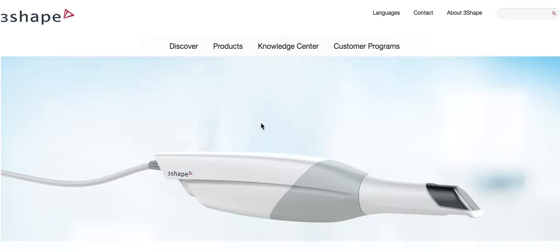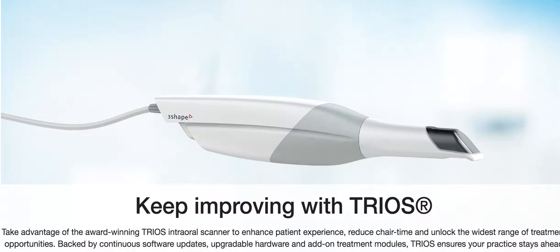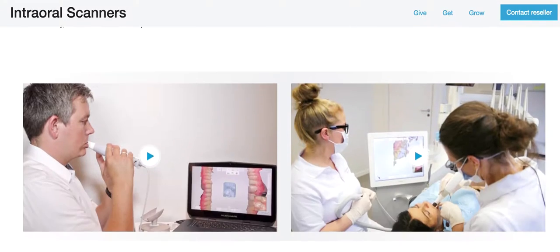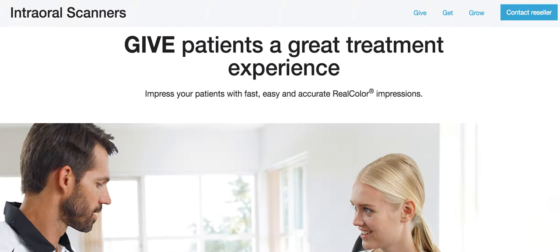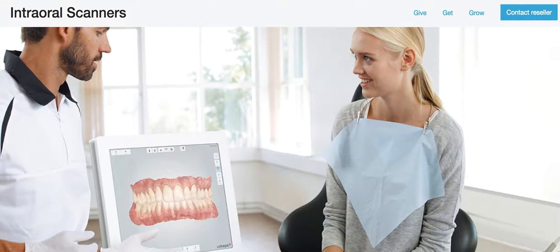So why should you get a scanner? A little bit of compare and contrast — the 3Shape versus the element. This scanner is really cool because you can choose the different grips. A lot of people don't like how bulky the element handle is — it's really heavy, though it's gotten better. But this one's even lighter, and you can get a pen-shaped grip, which is so much more comfortable for your wrist. Having your hygienist or dental assistant help with scanning is very comfortable, and we really want to save their wrists and prevent any carpal tunnel. So get the lightest one you can.